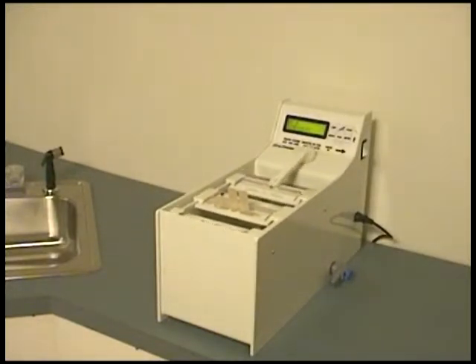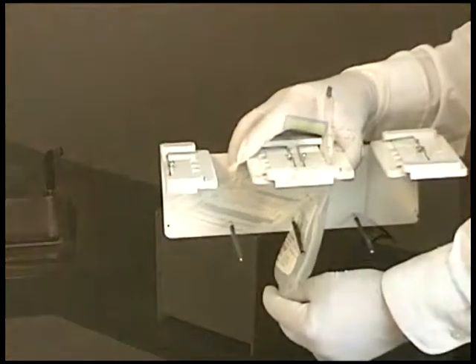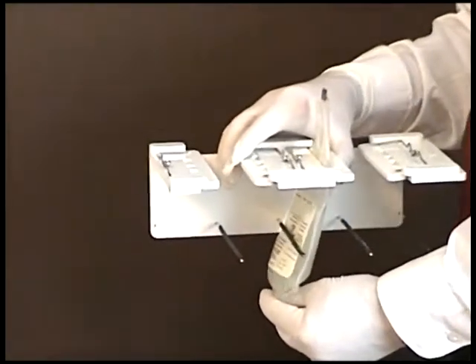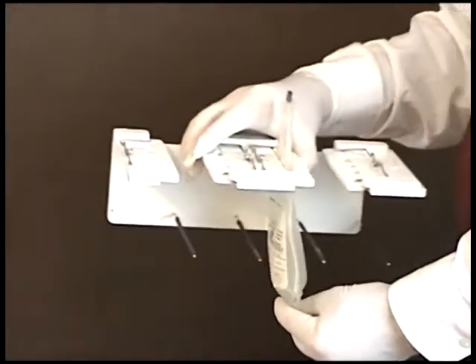The rack slides back and forth as the tempered water recirculates inside the bath. Because the plasma bag ports are held out of the water, a break in one plasma bag will not contaminate the remaining bags. As the rack slides back and forth, the hanging plasma bags are pushed against the bars, mixing the plasma inside to speed thawing.